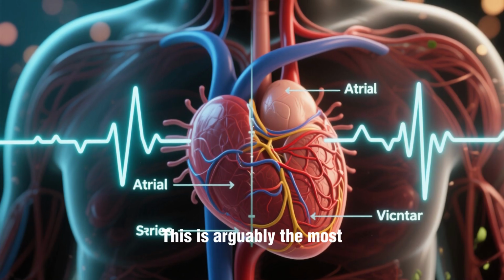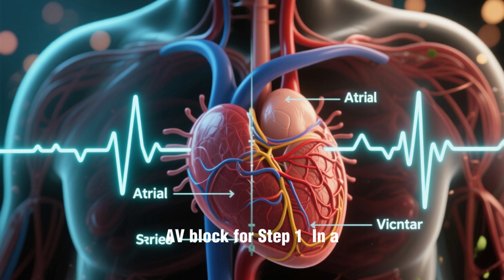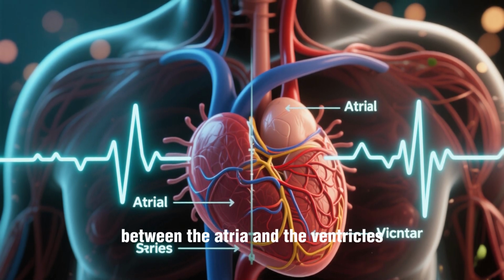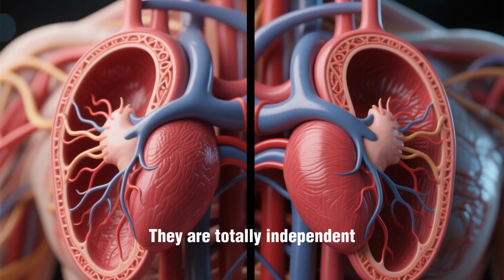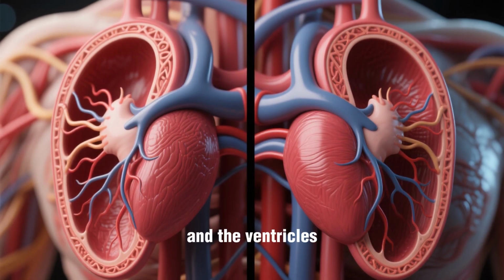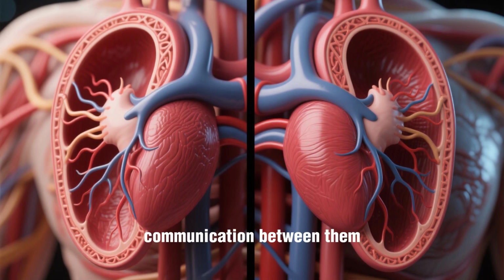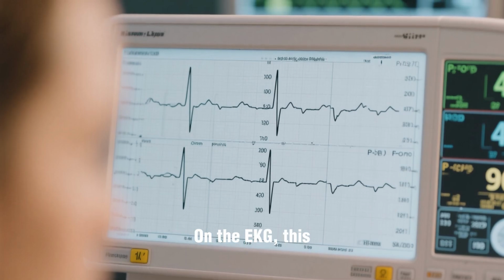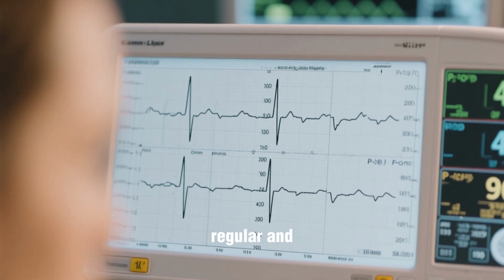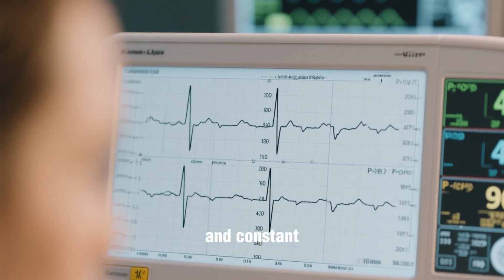Finally, we arrive at third-degree AV block, also known as complete heart block. This is arguably the most important and highest-yield AV block for Step 1. In a third-degree block, there is a complete electrical dissociation between the atria and the ventricles. They are totally independent. The atria are firing away at their own pace, and the ventricles are firing away at theirs. But there is zero communication between them. On the EKG, this creates a unique picture. The P-to-P intervals are regular and constant, and the R-to-R intervals are also regular and constant.